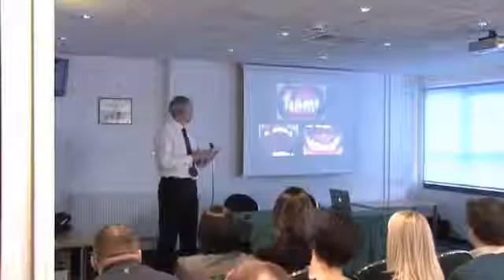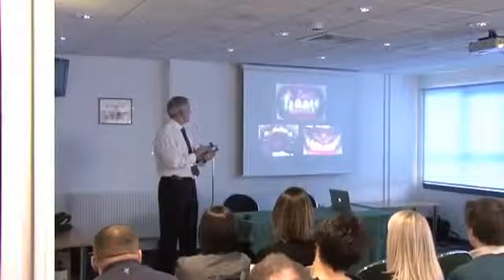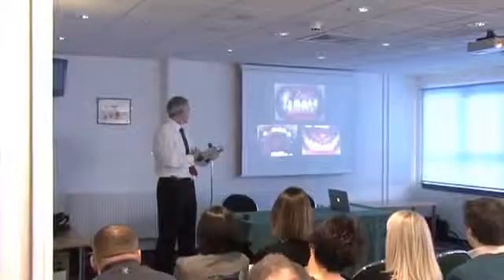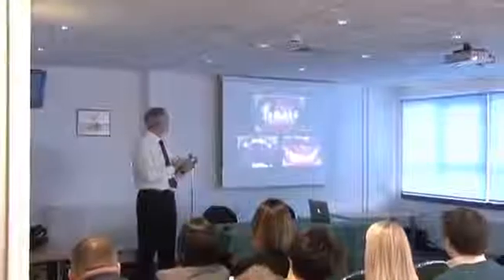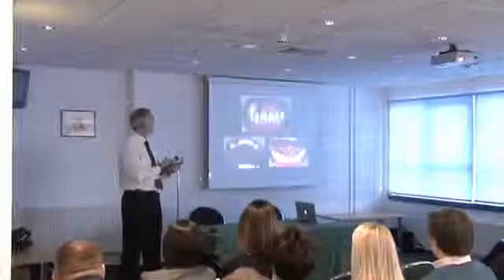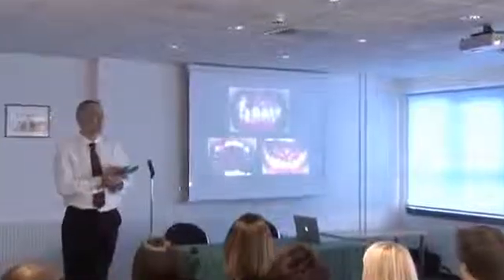This could be wear from the porcelain work. This tooth here is going to have to come out. So we know that this tooth here is going to have to go. It's loose. This one's periodontally involved as well. This one's in the wrong place. Solid canine, but it's in the wrong place aesthetically. What can we do about that?